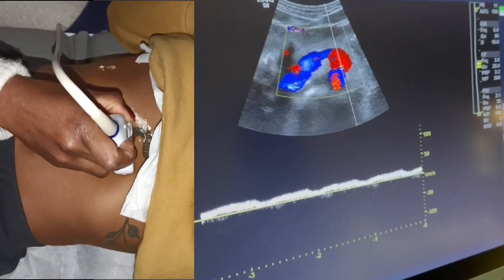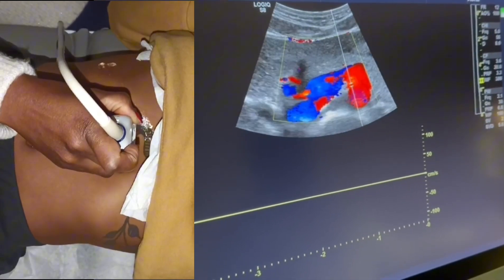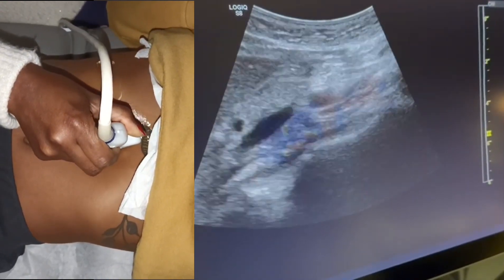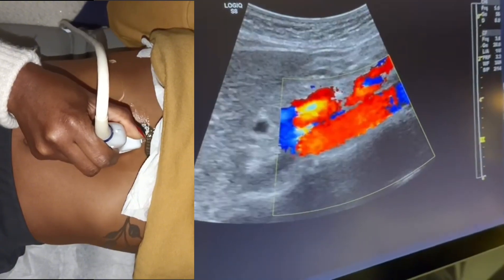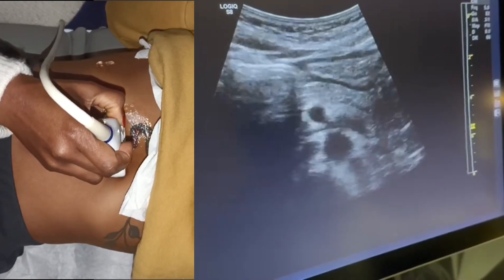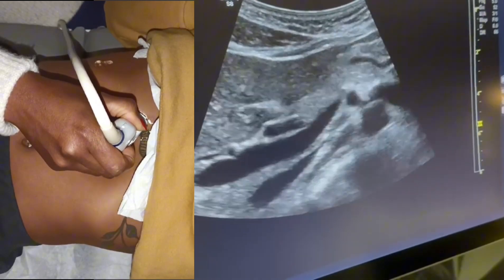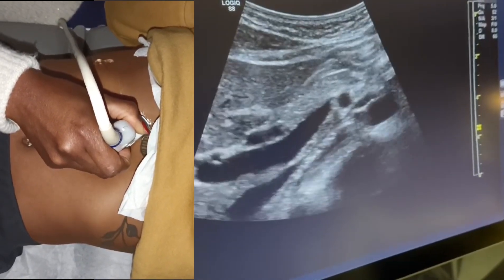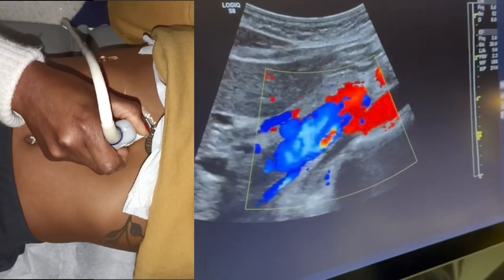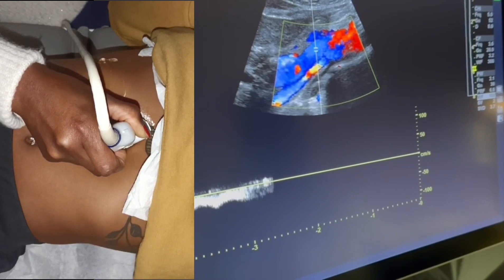You want to consider using angle when scanning, but I'm just going to Doppler without paying much attention to angle for time. Taking color off — that's my aorta. In transverse view, I'm slowly turning to the portal confluence to get my superior mesenteric vein. I'm going to put color on it and Doppler my superior mesenteric vein right there — window matters.